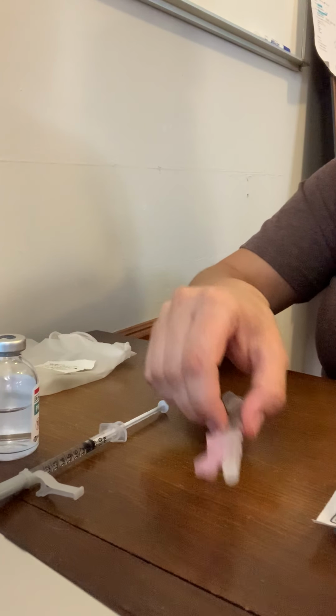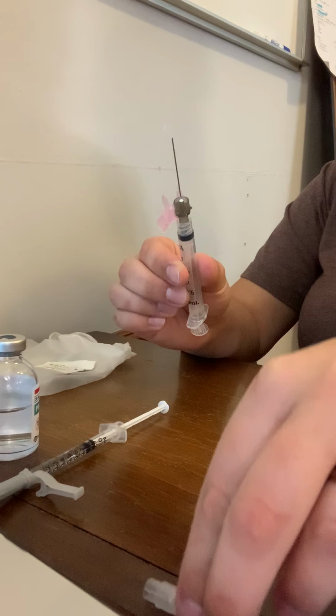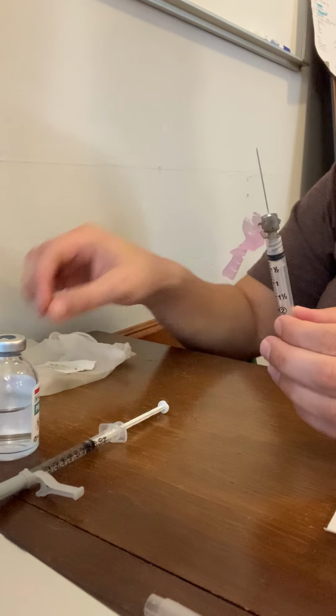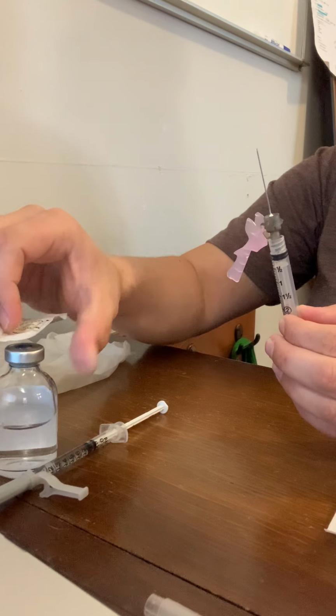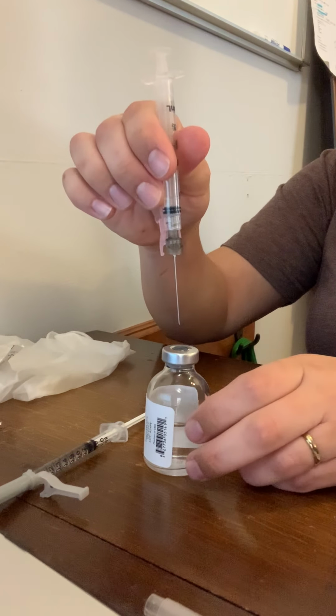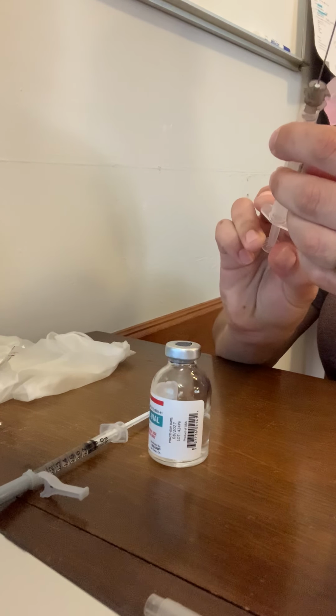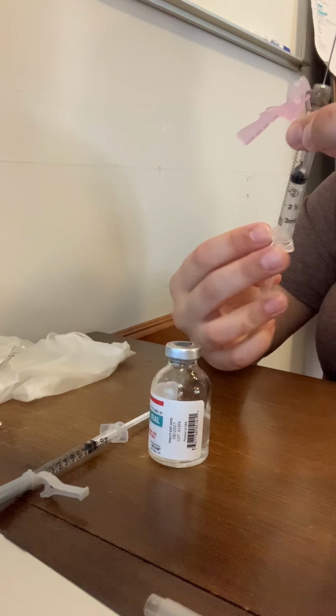All right, so I've got my 1.5 inch needle for my Phenergan. I will cleanse my vial, and I'm going to draw up 1 ml of air.